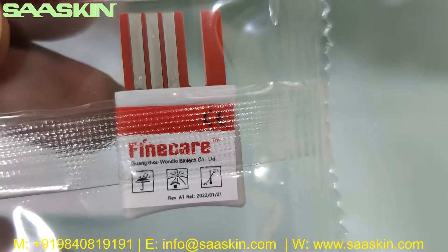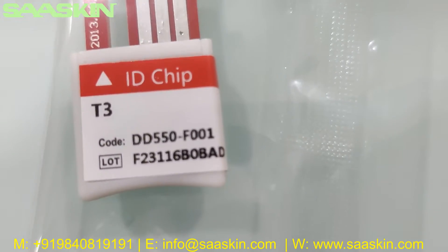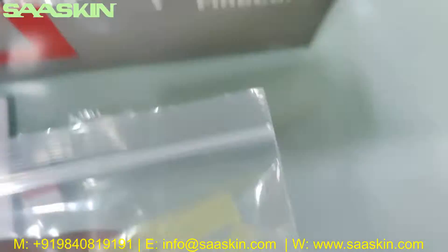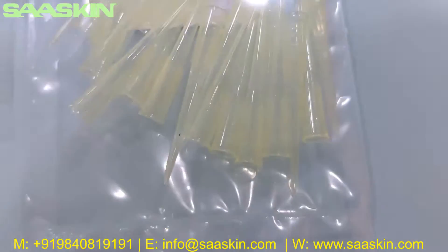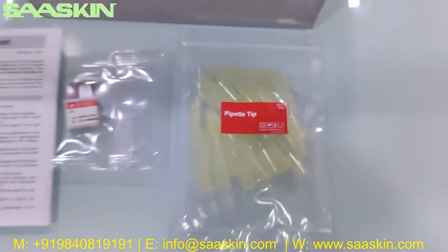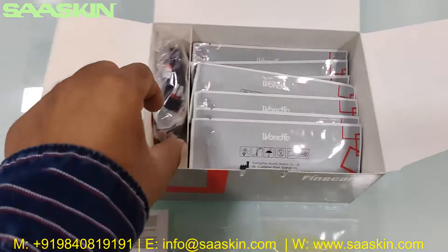Going further inside, there is an ID chip — you can see the ID chip here. It says FineCare and it matches with the lot number; the code is 53. Then you get 25 paper tips.